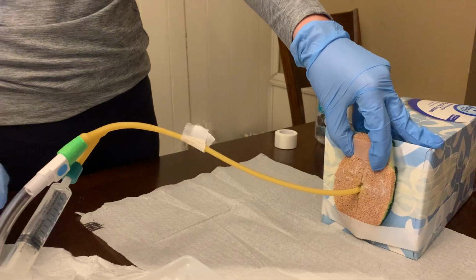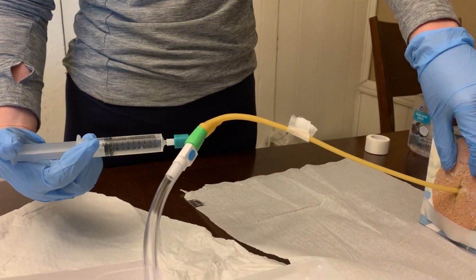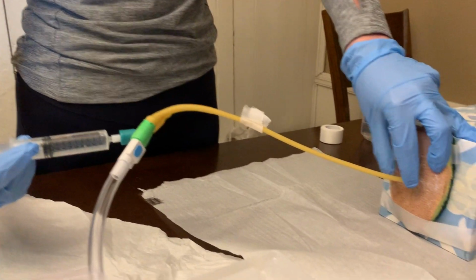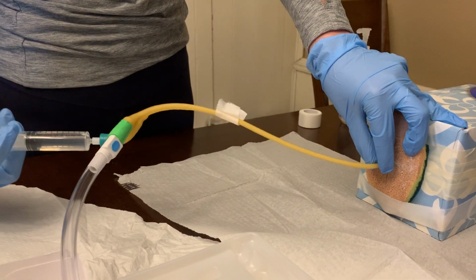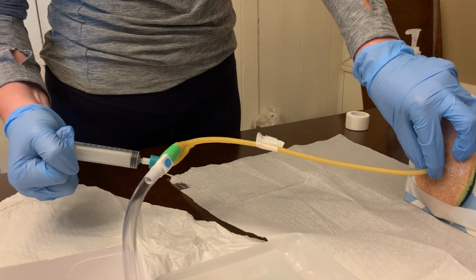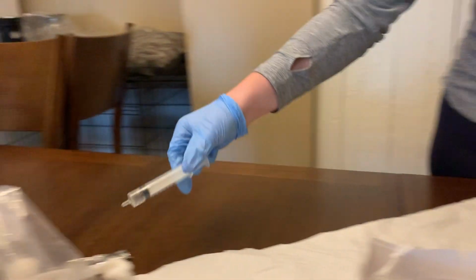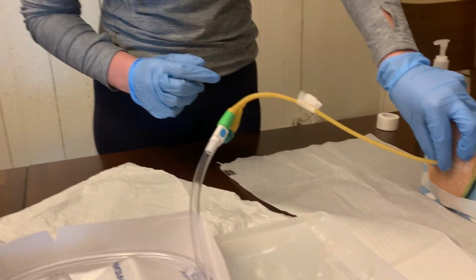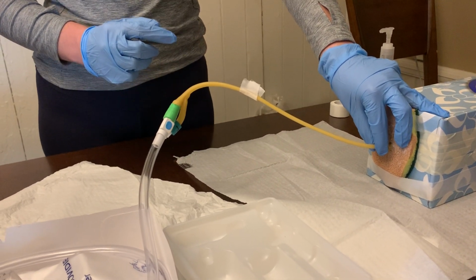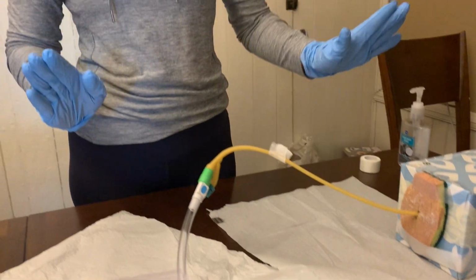Once that is in there, I will take my sterile hand to grab my syringe, and then using this other hand, I'm going to keep it on my patient's perineal area, but hold that tubing in place so I can inflate my balloon. Okay, so once that is done, I'm going to grab that syringe off and throw it away. And then I'm just going to give this a little tug to make sure that balloon is inflated. It seems like it's inflated. I've met the resistance there, so then I'm going to remove my hands from the area.